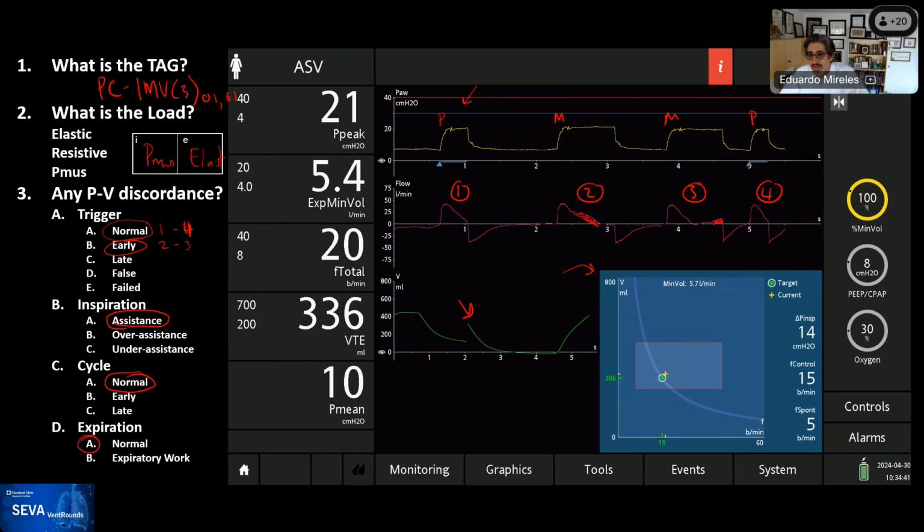Yeah, I think that in general, the group, I see those coming out rapidly. So decreasing your percent minute ventilation may be a way of increasing the spontaneous breaths of this patient. And this makes sense. If I put you on a mode that will bring your CO2 to normal or below normal, your respiratory drive is going to go away.